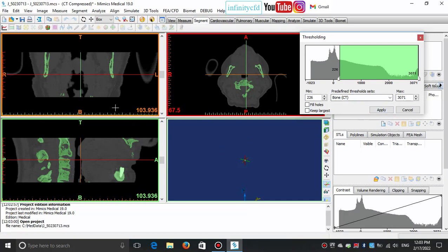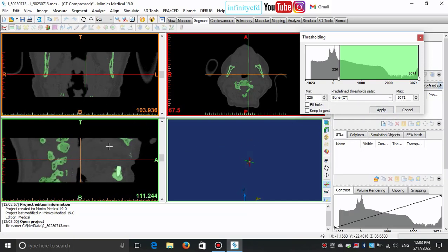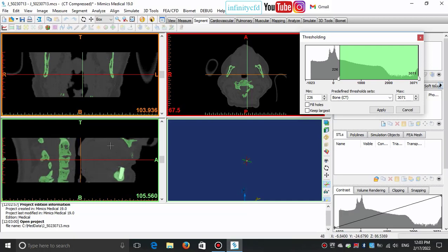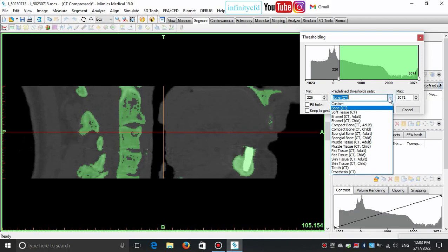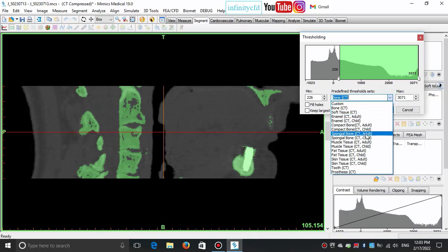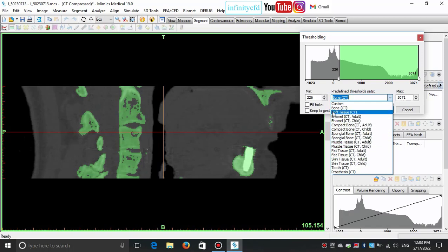Thresholding classifies all pixels within a certain Hounsfield range as the same color or mask. There are predefined settings for certain biological materials available in the Thresholding Toolbar. A lower threshold allows segmentation of soft tissue, whereas a higher threshold segments bone.